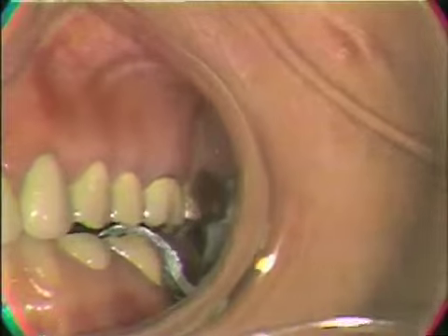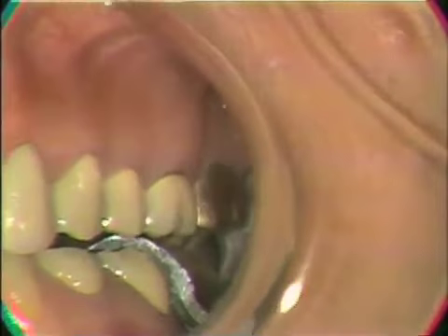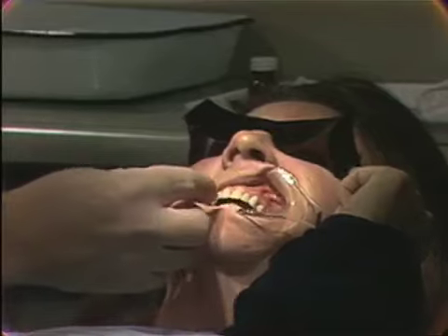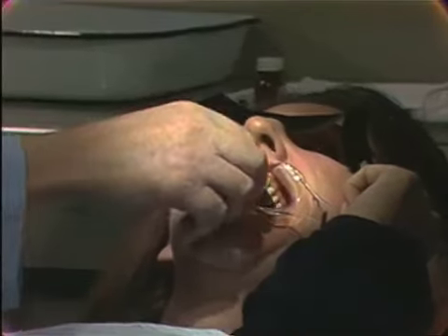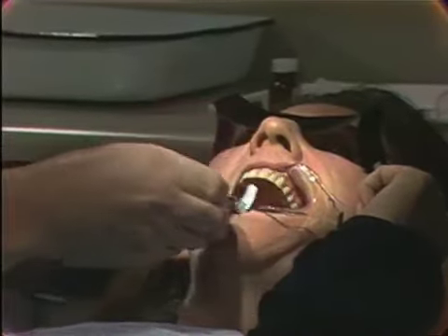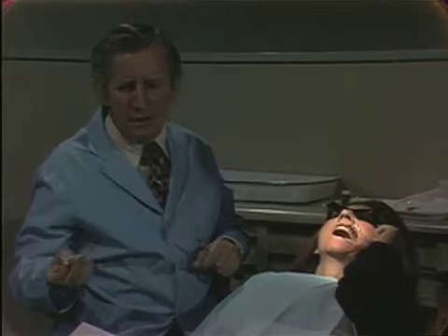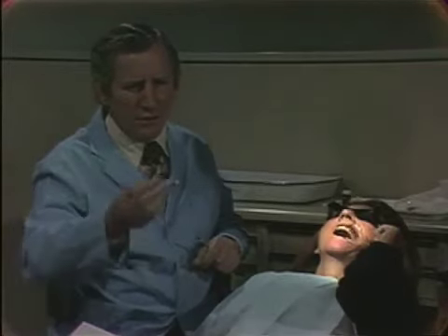Make sure that the opposing teeth do not hit that tray. If they hit... Open, please. Now practice the procedures 2 or 3 times to make sure that you and the patient know what is going to do. So you've got the tray loaded, and you have to butterfly the tray into the patient's mouth.